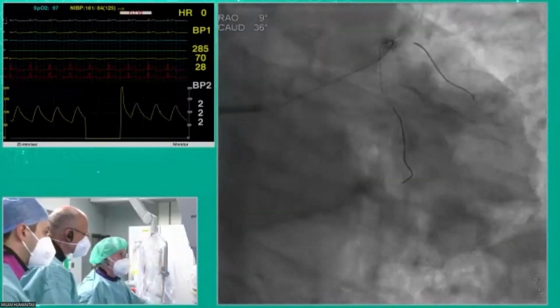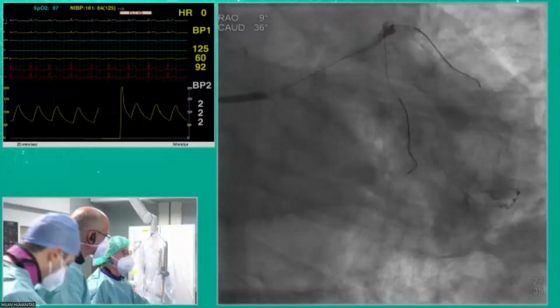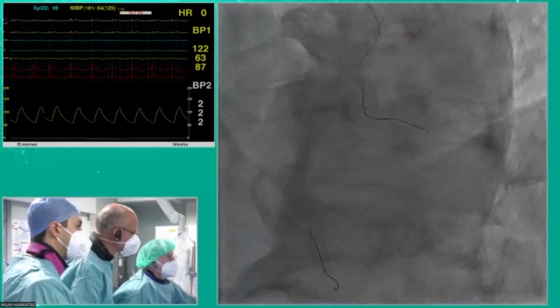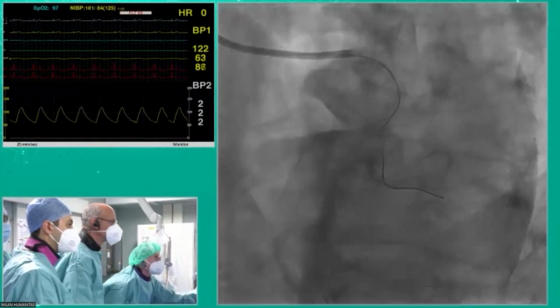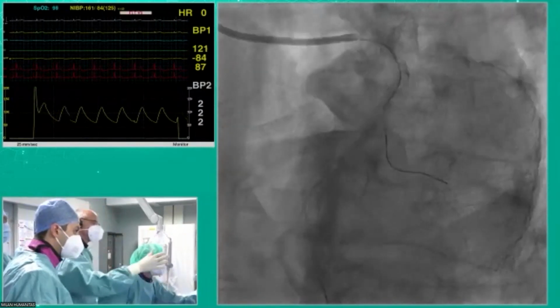I think it looks okay. We do a left cranial, creatinine is okay. All right, maybe a vote from the panel. With this result now, forget the cost considerations. Who puts a stent in? Raise your hand if you're going to put a stent in. Two, maybe.